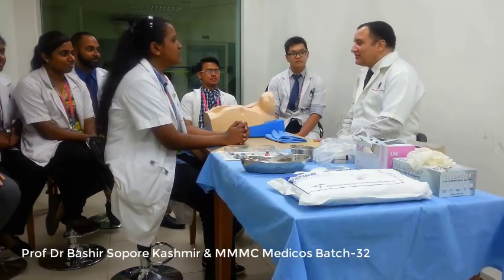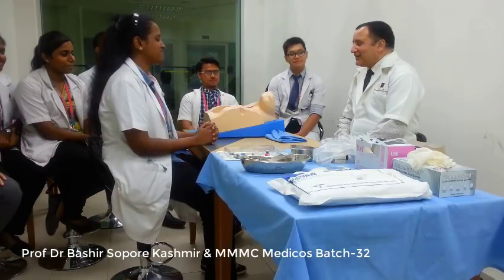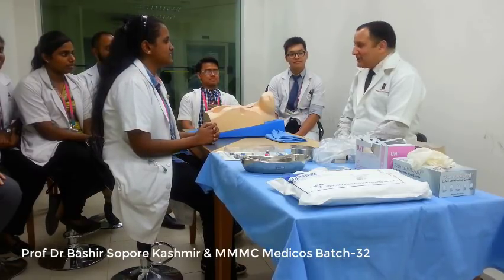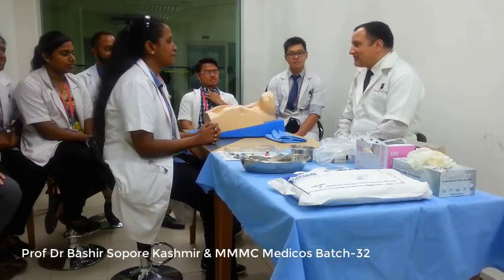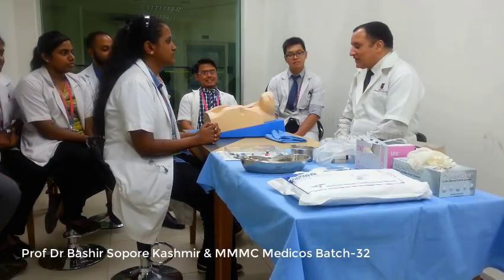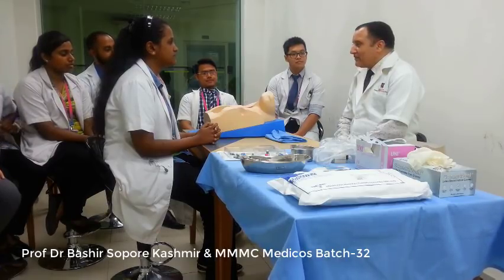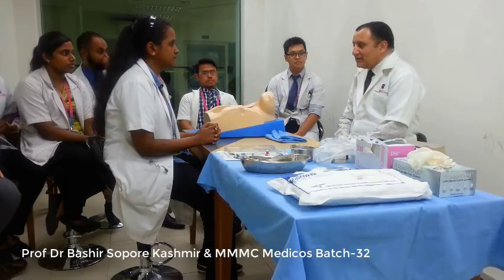And today we are going to talk about central venous catheterization. And before I talk about central venous catheterization, I would like to introduce you.